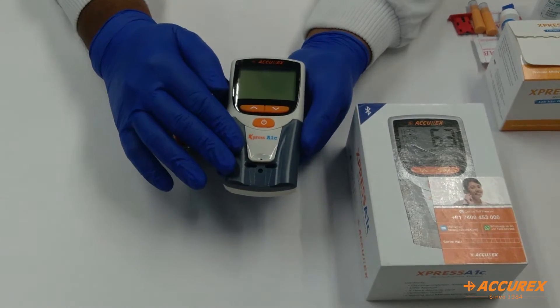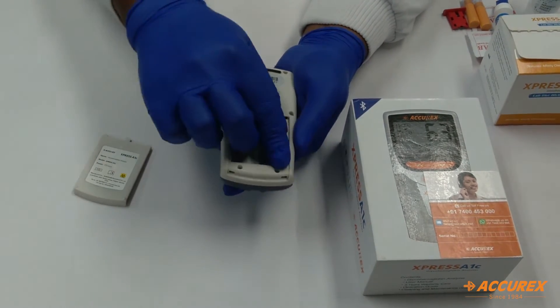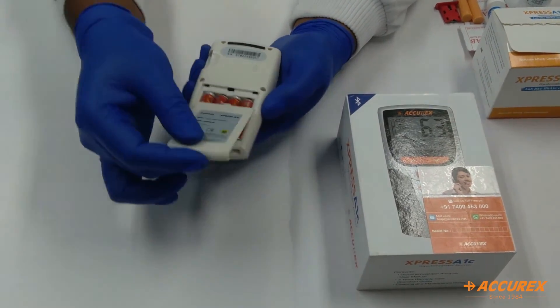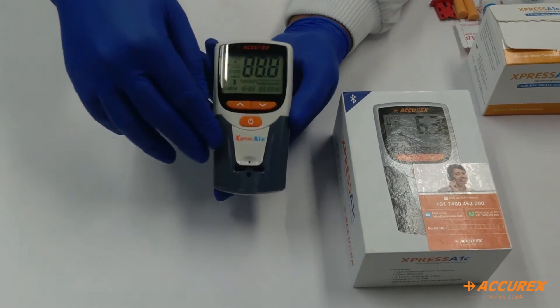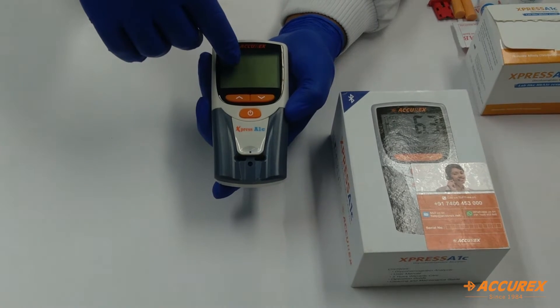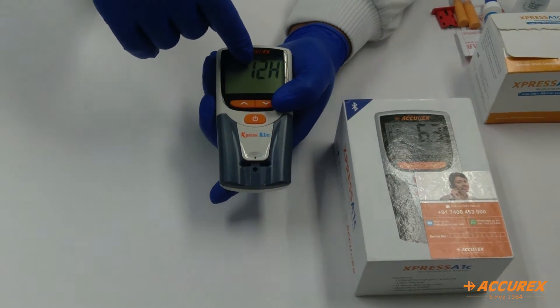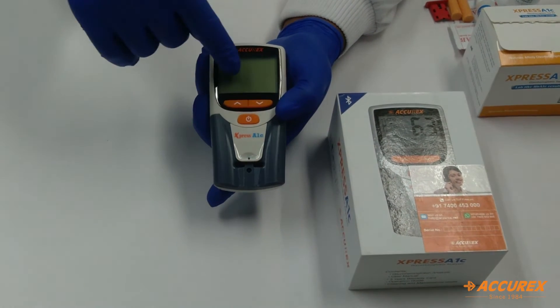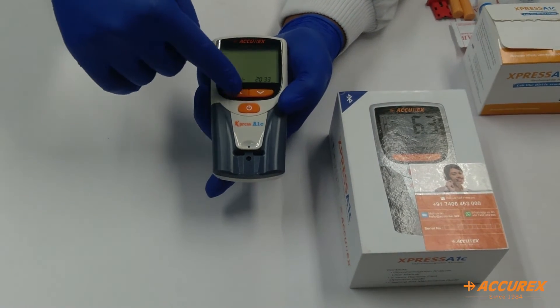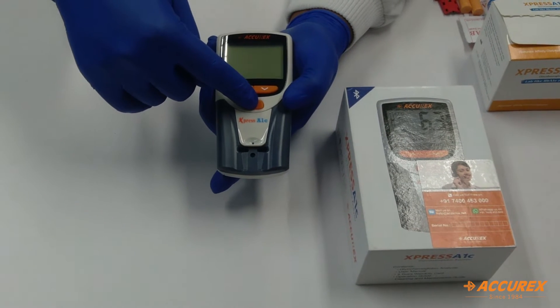Now we will put the batteries in the machine and start it. On the back side, just remove the panel and put the batteries. Welcome to the A1C easy test system. This machine is totally voice-prompted. When the batteries are put in, you can see indications to set all the settings — timing and date format. It is asking for 24-hour or 12-hour format. Set accordingly and click OK. Then set the date and time and press OK. Once it is done, the machine will turn off.